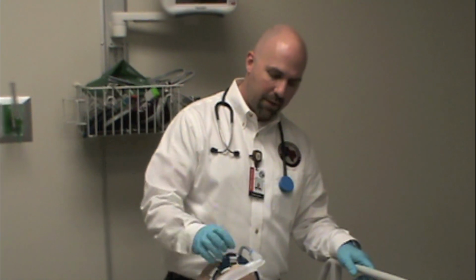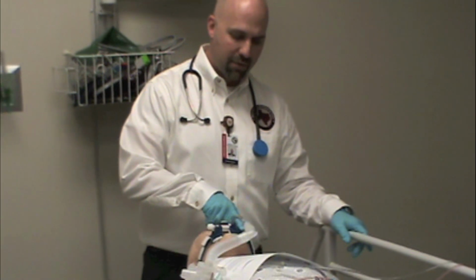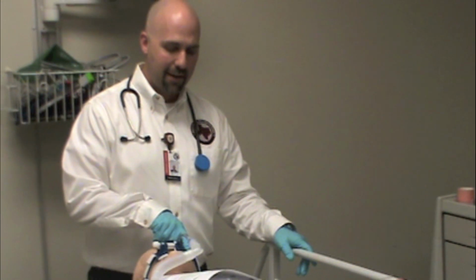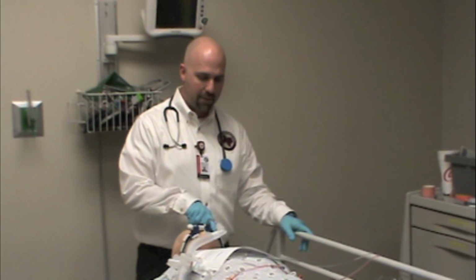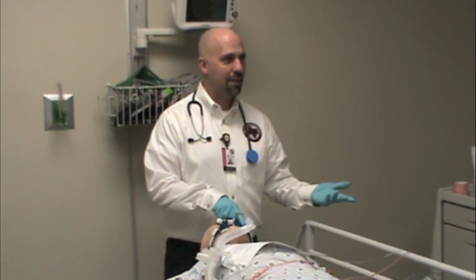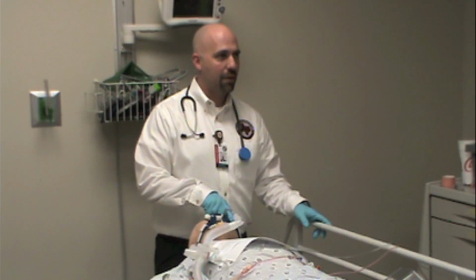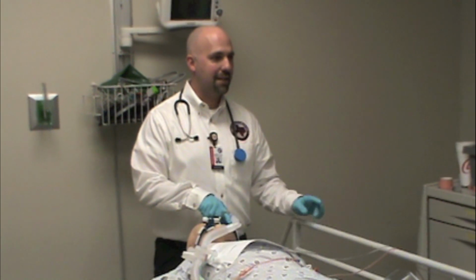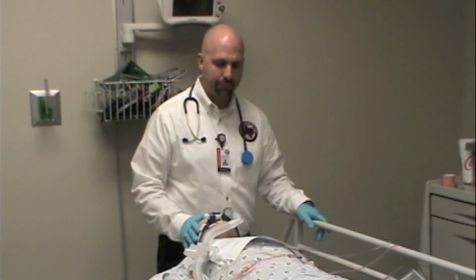You want to always be aware of the depth of the ET tube at their teeth. So you want to make sure that if you started out with an ET tube at 21 centimeters at the teeth, that you arrive at the sending hospital, the receiving hospital with the same depth measurement. Most adult patients are going to have an ET tube between 21 to 23 centimeters at the teeth as an average. And if you have any doubt, you want to make sure that you have access to a chest x-ray before you walk out the door so you can see exactly where the position of the ET tube is. And the physician should feel good about showing you that.